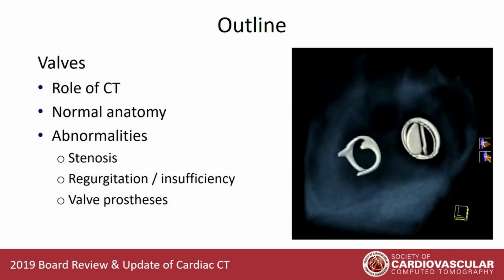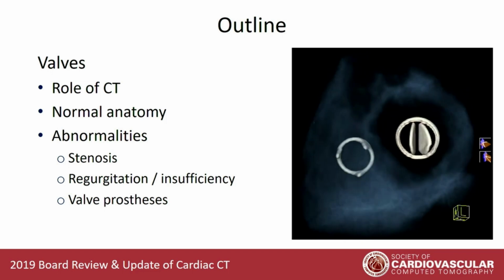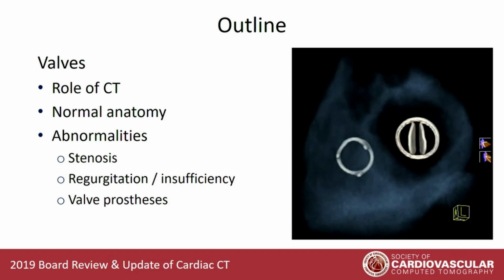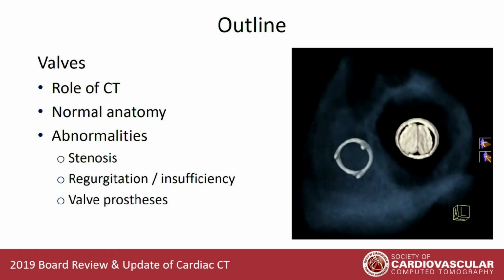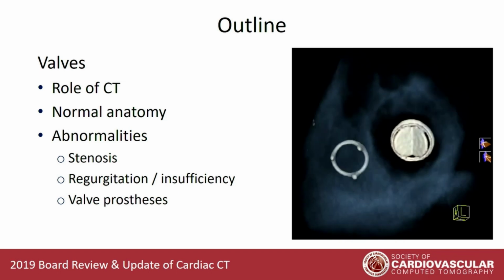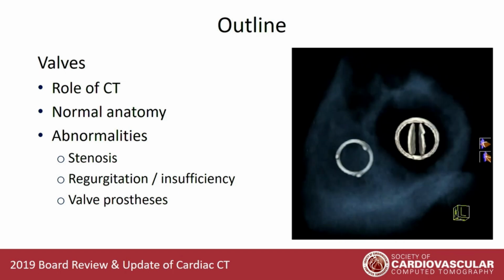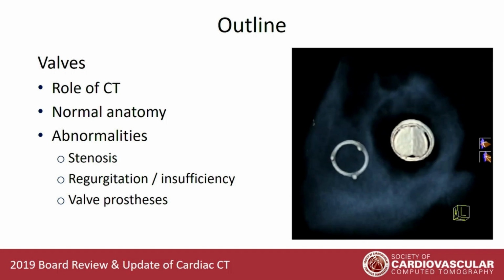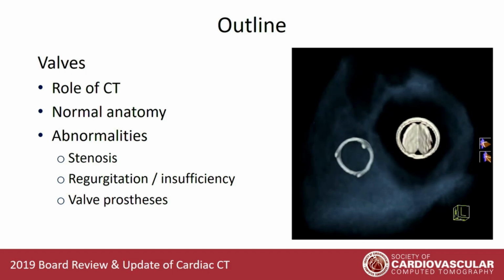And when we look at the various different things, again, starting out with valvular disease, we'll talk a little bit about the role of CT, because as with so many things, what we have to offer for our patients in the evaluation of cardiac valvular disease is pretty specific. And cardiac CT is a complementary modality to the other more established modalities, cardiac MRI and certainly echocardiography, for valvular heart disease evaluation.